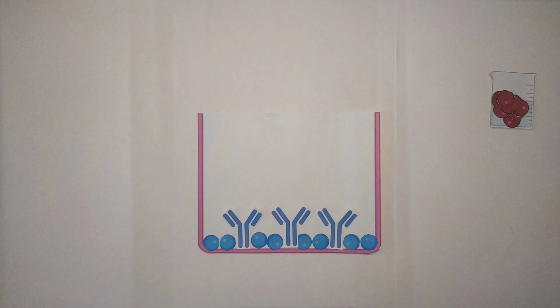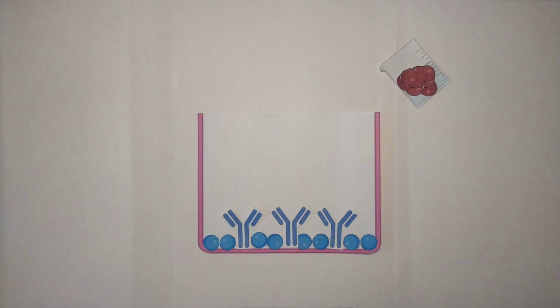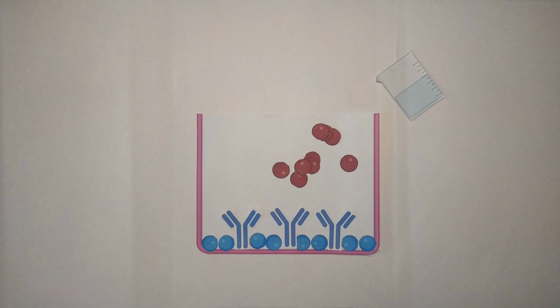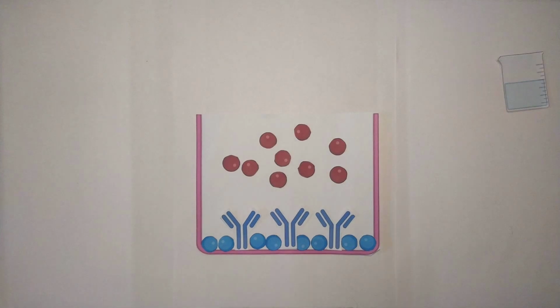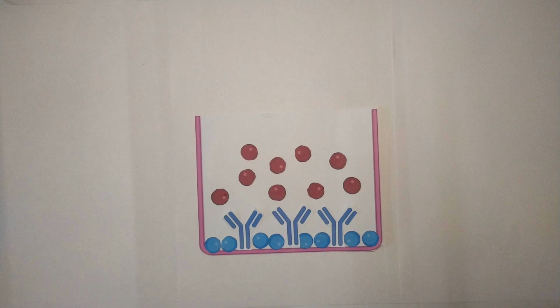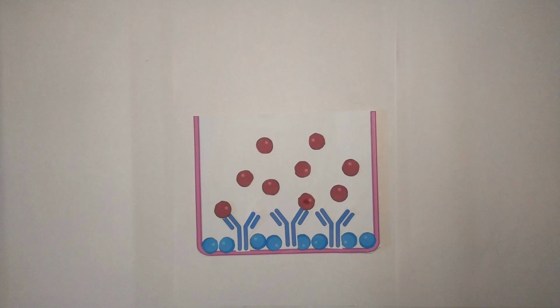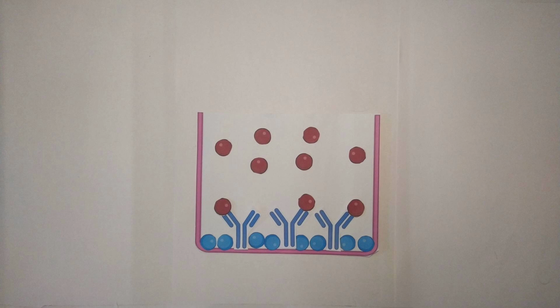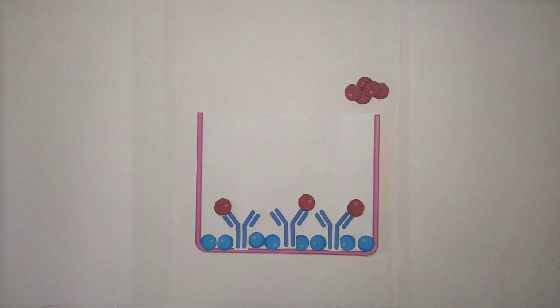The third step is addition of antigen. In this step, the patient's blood serum sample is added. The serum might contain antigen specific for the standard antibodies and the disease we are trying to identify. If the serum contains the antigen for the specific disease, then it will bind to the capture antibody. After addition of serum, the wells are incubated at RT for 30 minutes. The wells are then washed again with distilled water to remove unbound antigens.